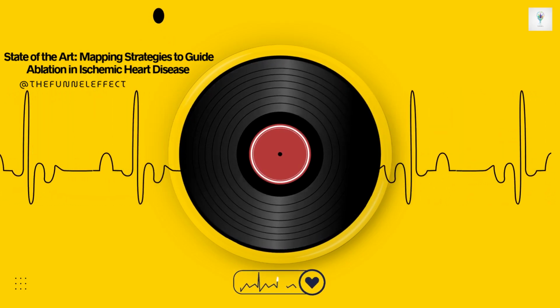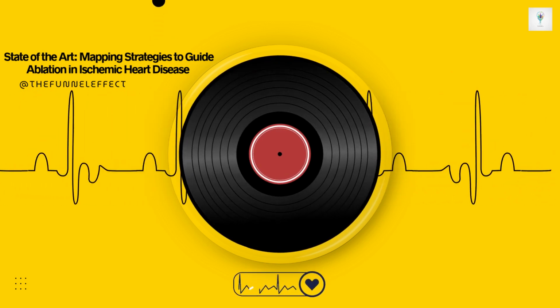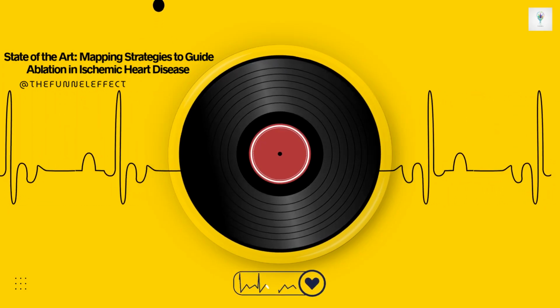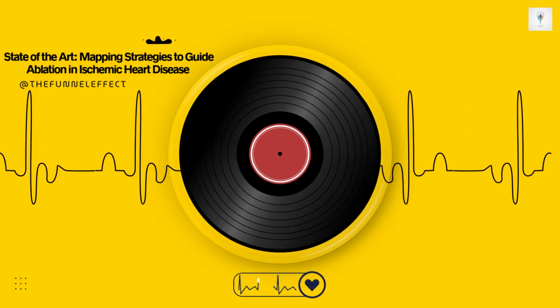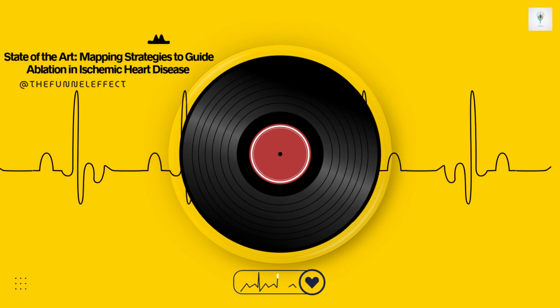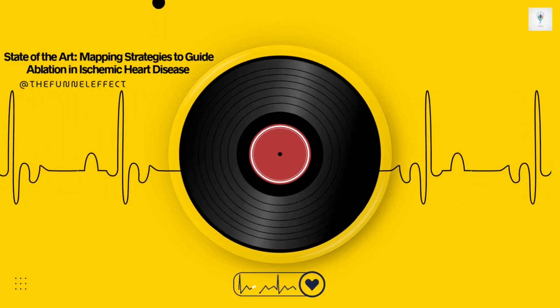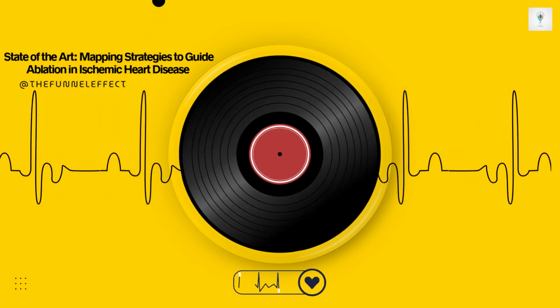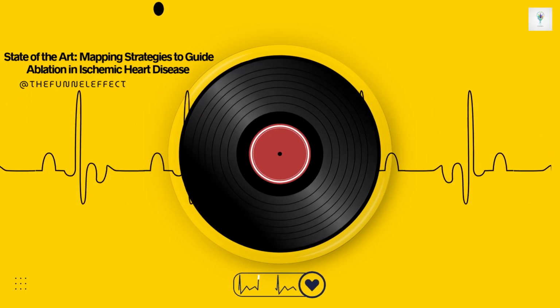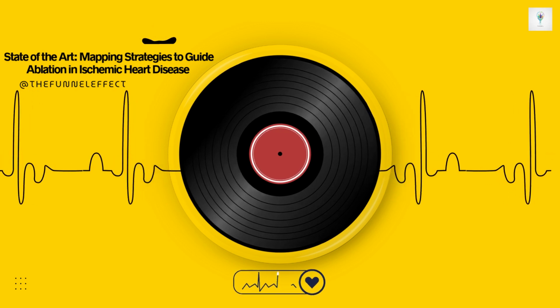Pace mapping is conceptually quite elegant. The idea relies on the fact that the overall shape of the QRS complex during VT is mostly determined by how the electrical wave spreads through the healthy heart muscle after it leaves the scar. So, if you place your catheter right at the exit site of the reentry circuit's isthmus and pace from there, the way the activation spreads out into the healthy ventricle should be identical to how it spreads during the actual VT. Therefore, the pace QRS morphology on the ECG should look like a perfect match to the clinical VT morphology. A perfect match tells you you're at the exit.